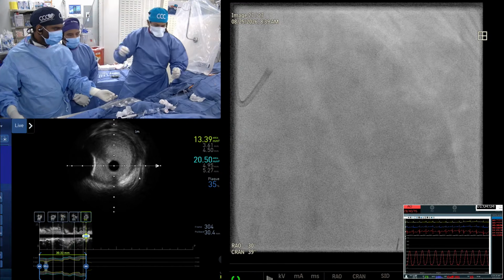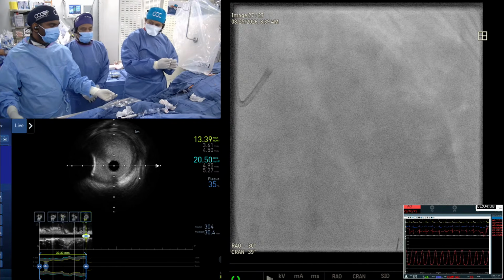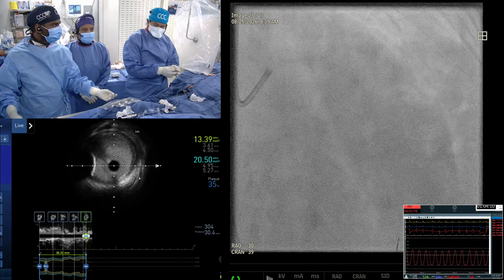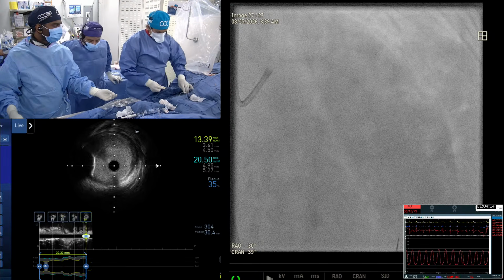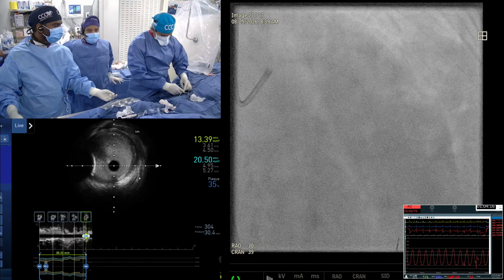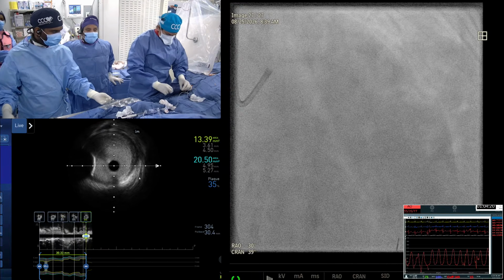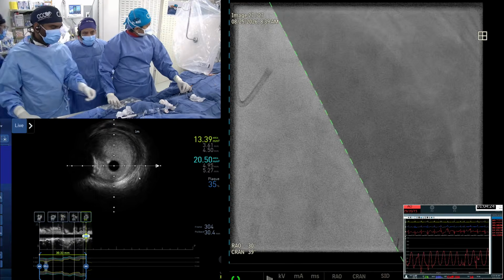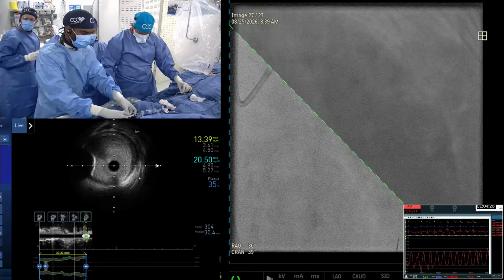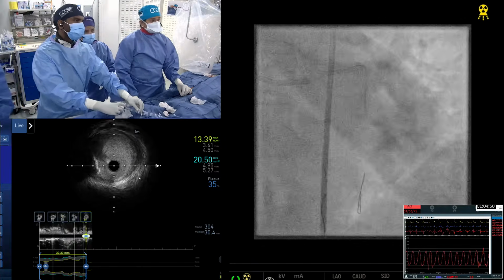And for MSA, everything else, the dissection, malposition, maybe a little less with IVL. Then for the purpose of nodule shaving, some data support that orbital may do a better job, particularly if there is calcium around the nodule, because you'll shave it better. But we didn't see that, so that's not our algorithm, that in a nodule you have to use orbital.